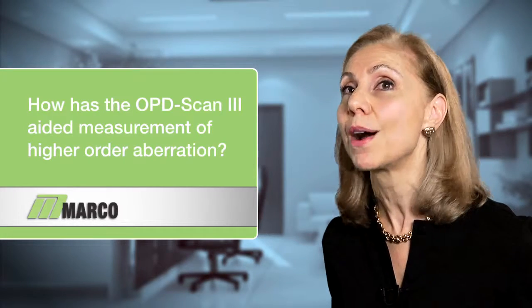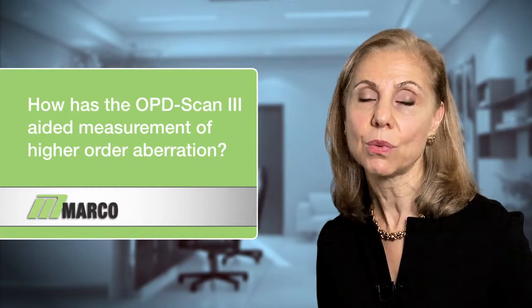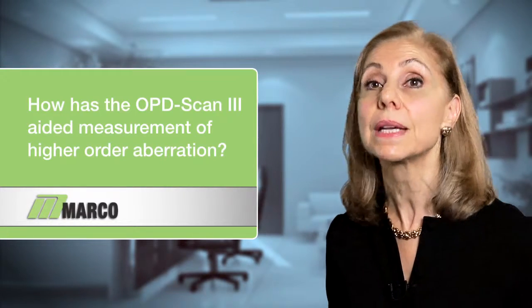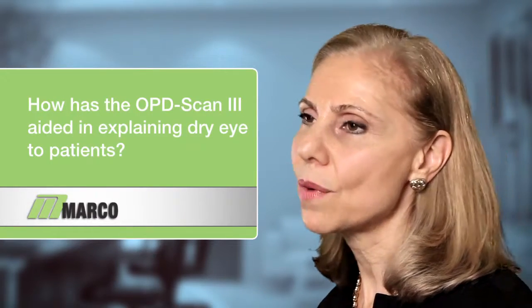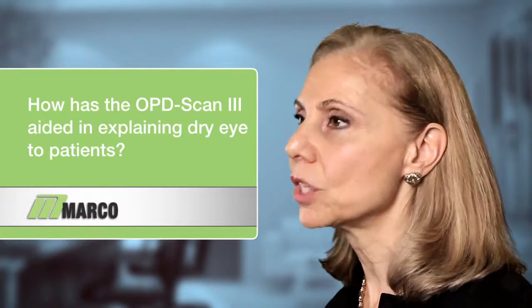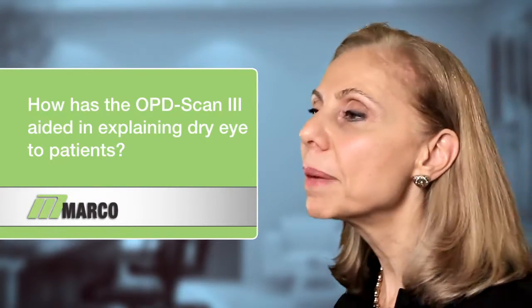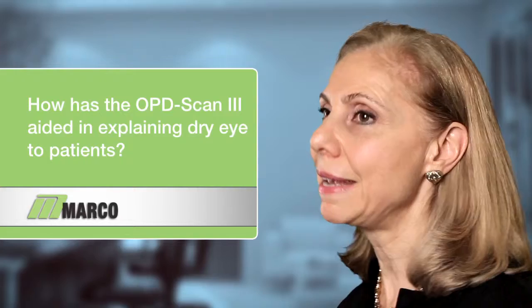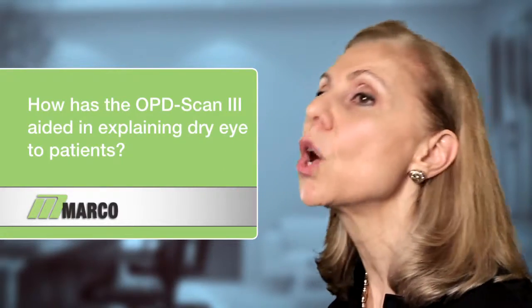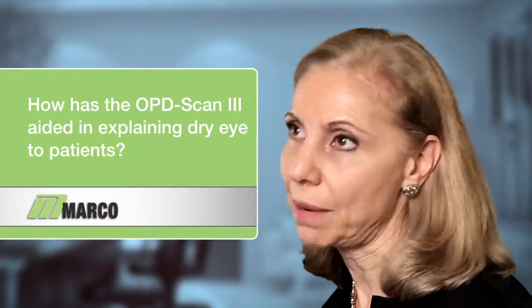Moreover, it's part of their higher order aberration, and that cannot be corrected. And it's through the OPD-3 that I'm able to not only understand it myself, but explain it to the patient and their family members. At the time of the cataract visit, with each of my patients, I go over multiple maps of the OPD-3. I'm a believer if you don't discuss something with a patient beforehand, the patient will think either that cataract surgery caused it, or I gave it to them, or they will blame the entire process of the surgery or blame the surgeon.